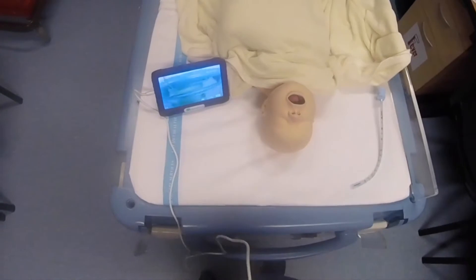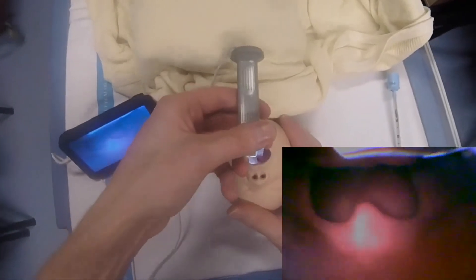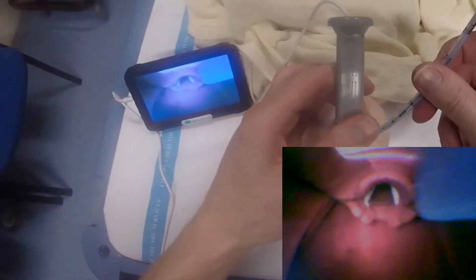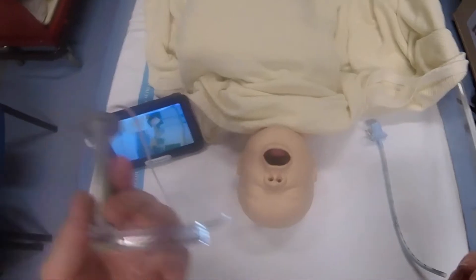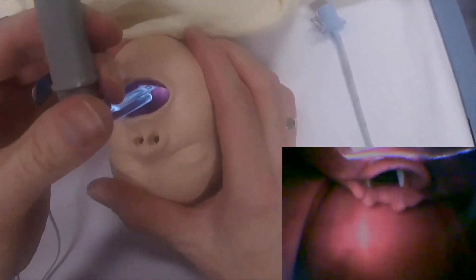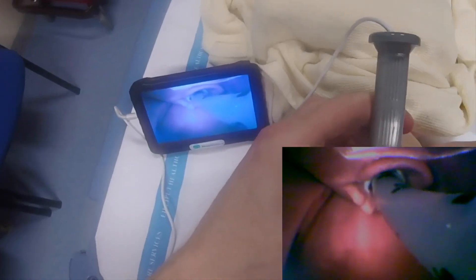I'm going to turn the recording function on — I've got a Miller 1 blade with a neonatal model. So there's the view. I'll take the endotracheal tube, doing the intubation using the screen. You can also do this with direct vision, so I'm going to do it just using direct vision. I've got my view, and then I can drop the endotracheal tube in with direct vision.